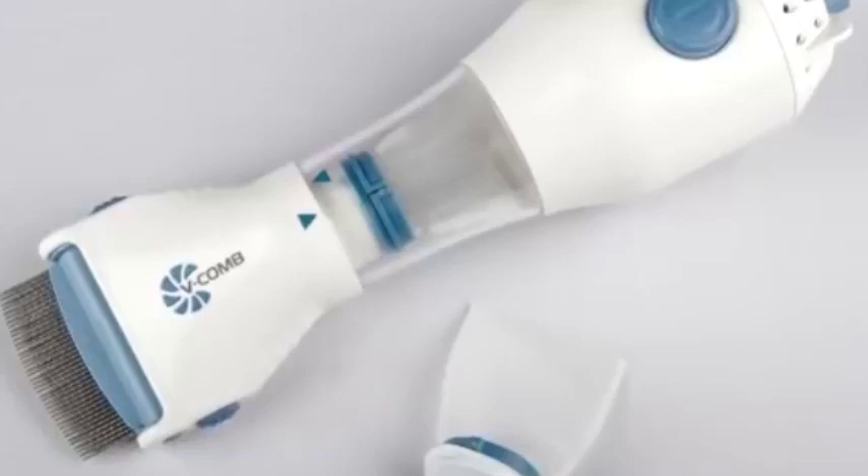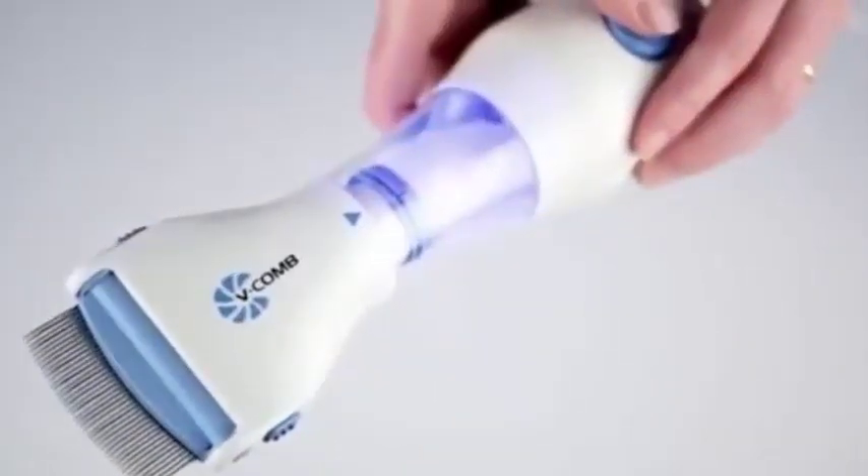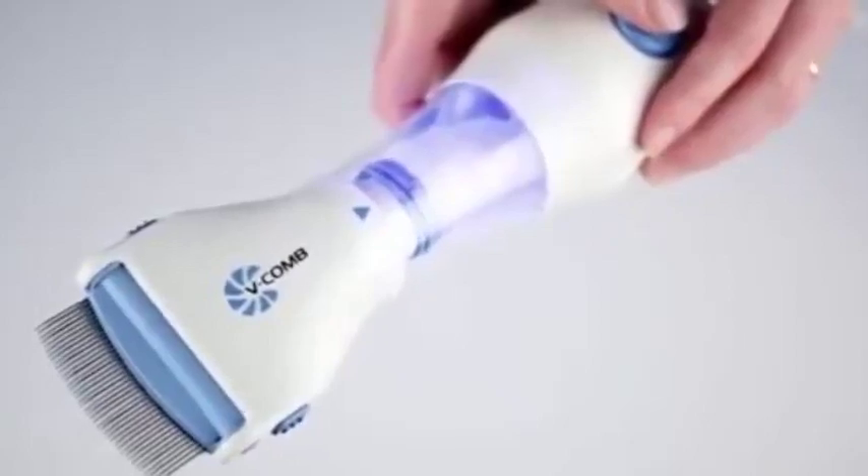The V-Comb extracts head lice and eggs from the hair into a disposable capture filter housed within the unit. The filter unit is illuminated by a bright LED light so you can see what has been removed from the hair.